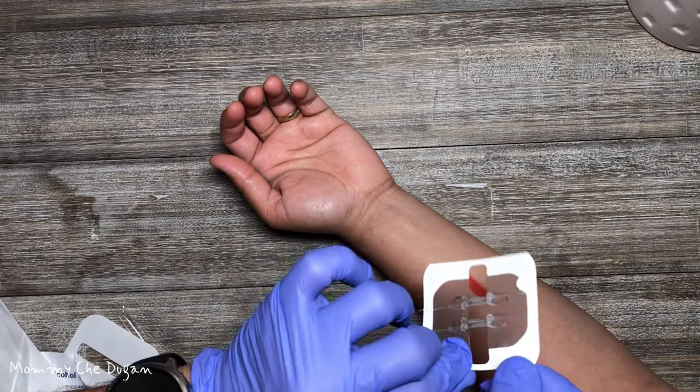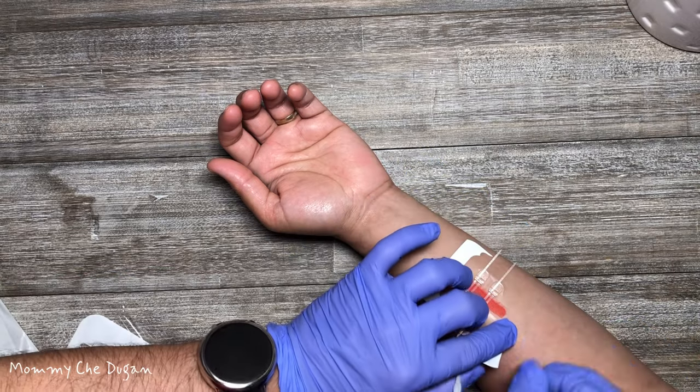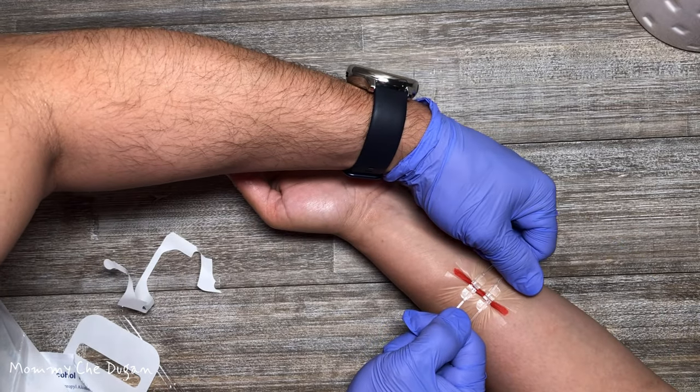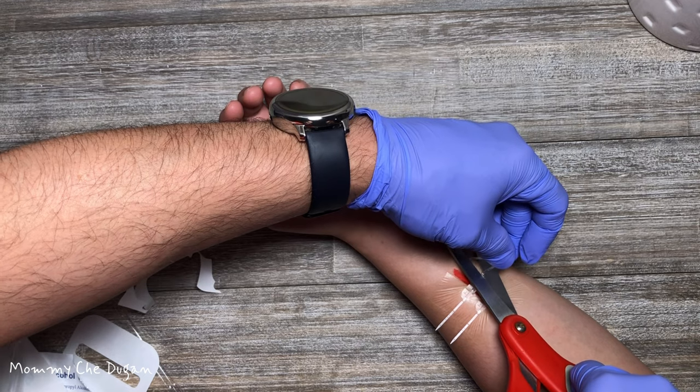Remove the release paper. Put it in the center of the wound. Remove the upper release paper. Close the strap until the wound is closed. And trim the straps.